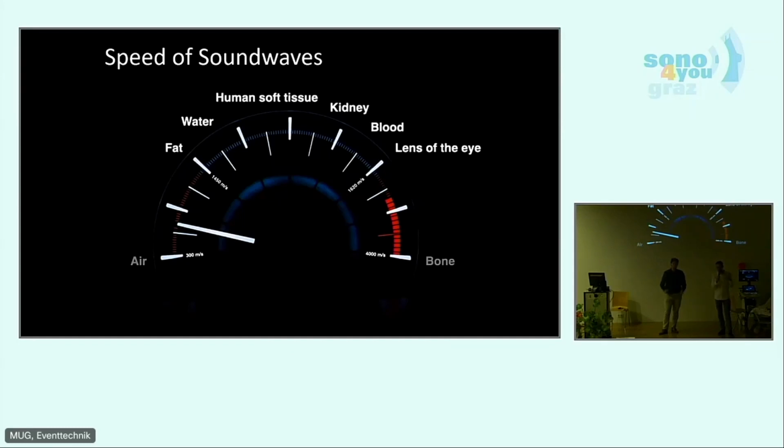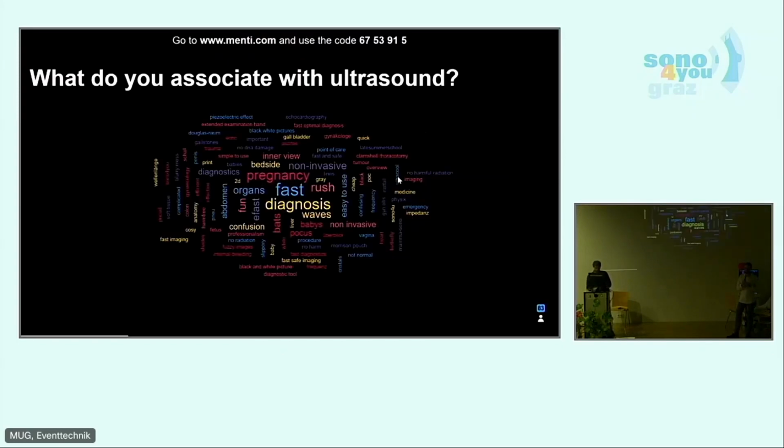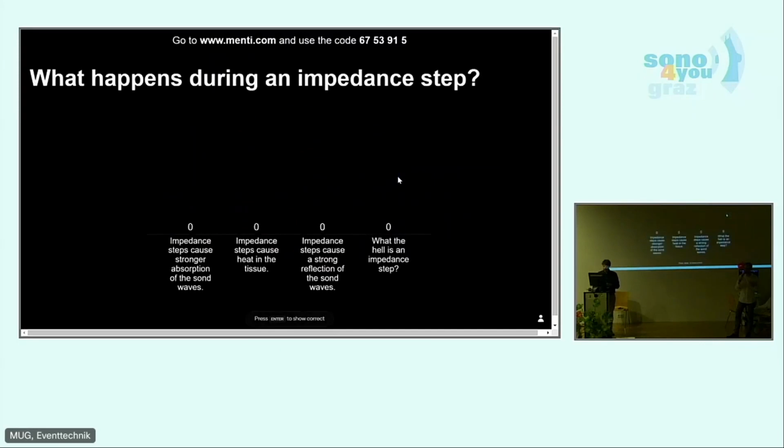So, when we put a transducer or an ultrasound probe on our body and the ultrasound wave is going through, you would have a change between different tissues and a change in the impedance. So we call that an impedance step. And now we have a question for you. What do you guys think happens when you have an impedance step? It's a question for the phone, of course.